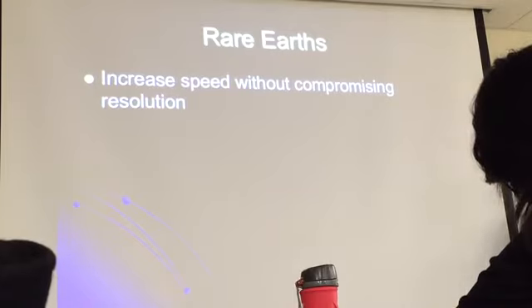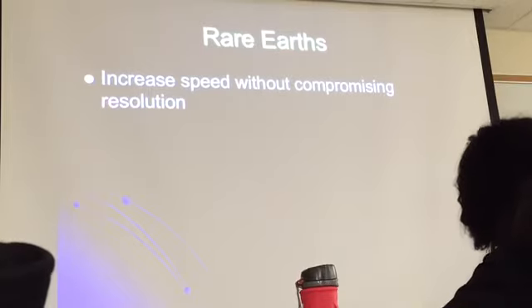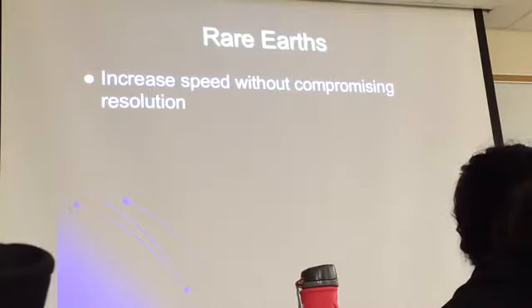What do you think they fit? Do you think that they have better resolution or worse resolution? Worse. All of them have worse resolution. All of them. The best they can do is about 3 lines per millimeter. Wow. Yeah. And those are the really good systems, the mammography systems, about 3 lines per millimeter.